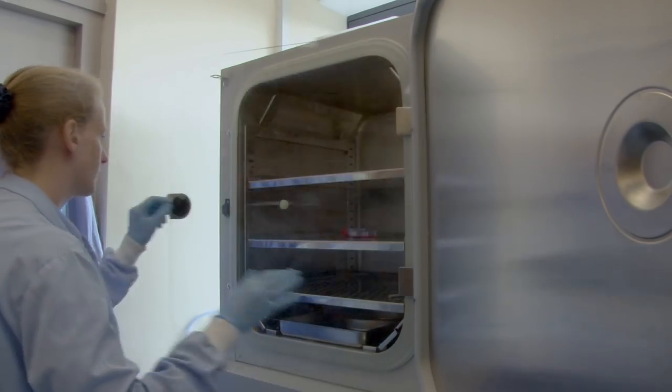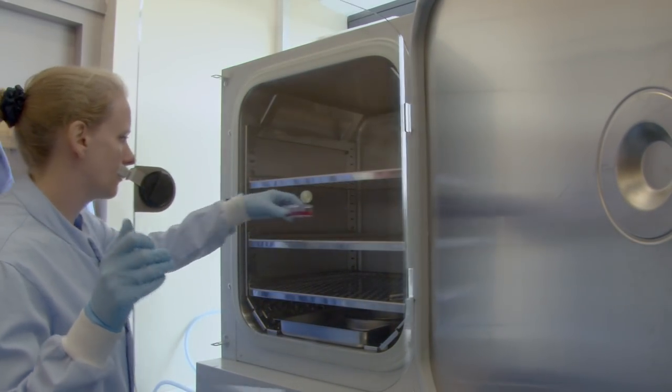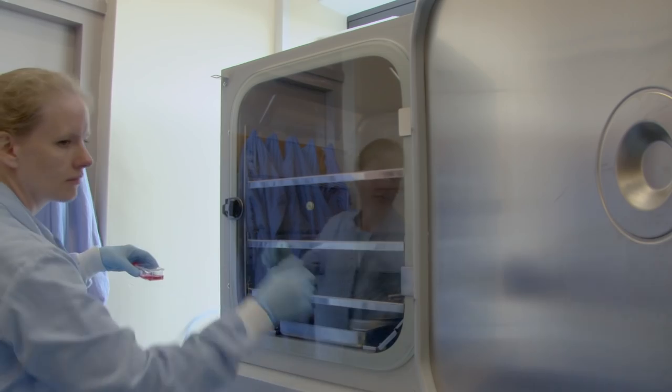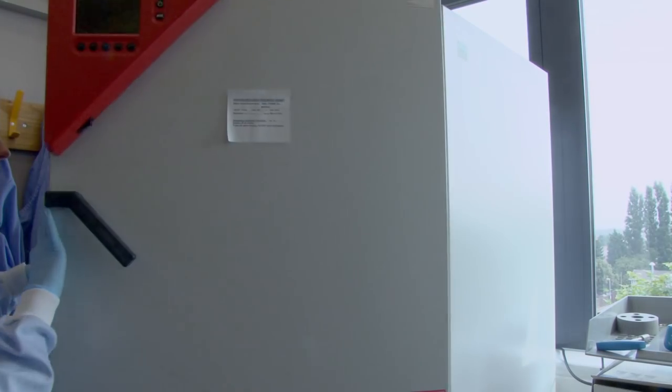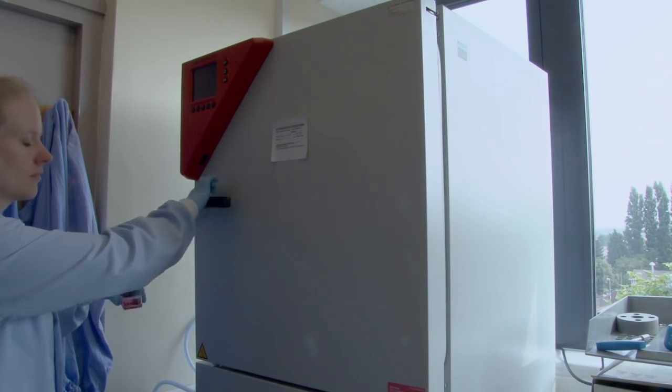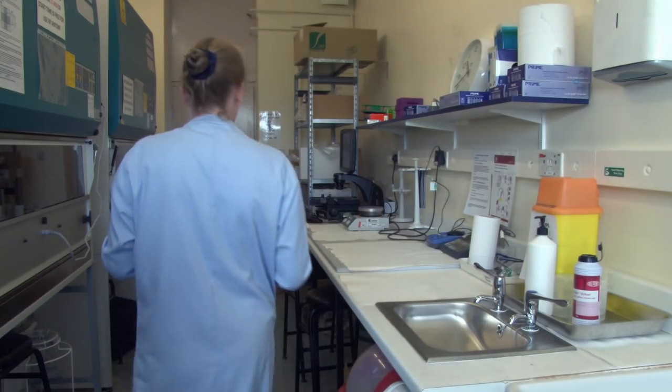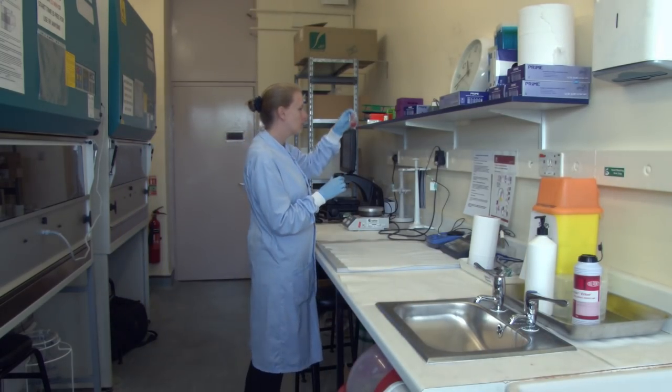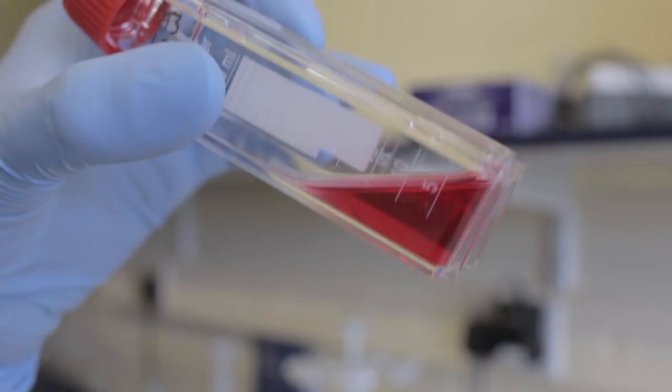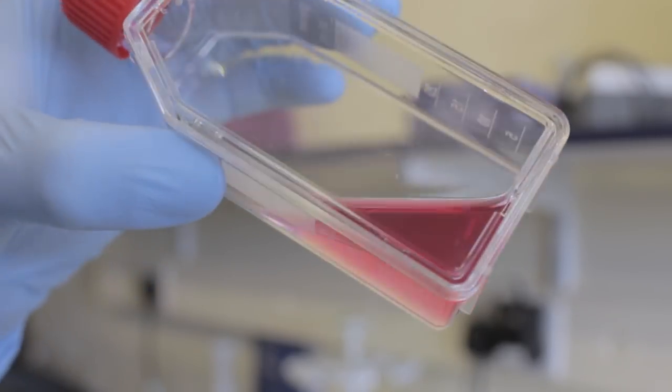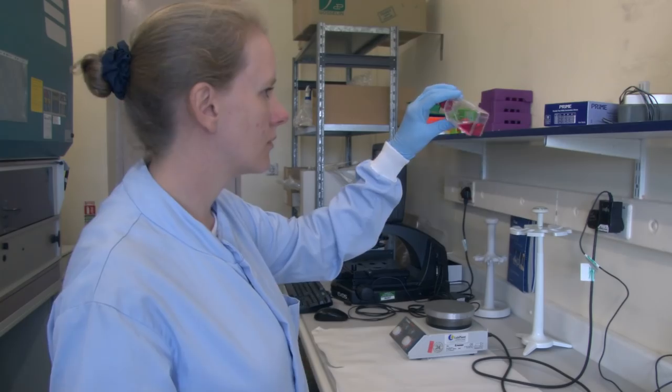The first step is to visually inspect your culture. Remove it from the incubator and look at it. The cells should be stuck to the surface of the culture vessel. There should be no apparent mold or cloudiness and the color of the medium should be unchanged.